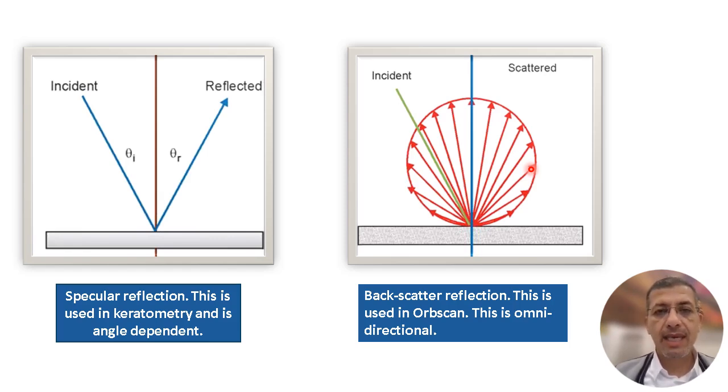Number one, it has a longer processing time, and the acquisition time for the image is long because it has to take both the Placido disc image as well as the scanning slit, so some patients might not be cooperative, and also the image might be truncated by the blink of the patient.